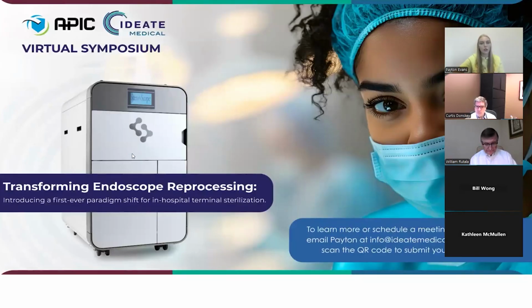Let's see, Kathleen, this is a good question for you. How much did it slow the overall flow in a busy site? So I was actually reading that as well, and I think there were some questions about whether or not additional cleaning needed to be done. No, we did not feel or identify a significant change in the amount of time. It was about the same amount of time that the scope would have had to spend in the AER or in the sterilizer. And the connection process was pretty quick once you learned it.